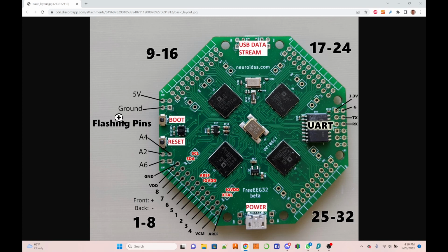VCM is already internally connected on this whole board. So if you connect one of these VCMs, you're done. You don't have to also connect this and this and this. Internally on the board, all the VCMs of all the 4 ADCs are connected. So that's an important little thing to take note of.